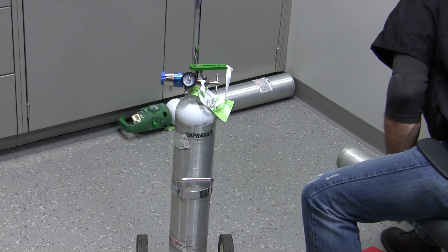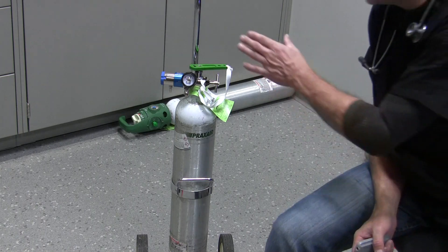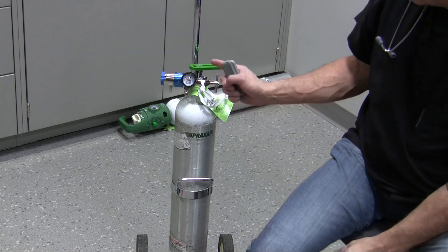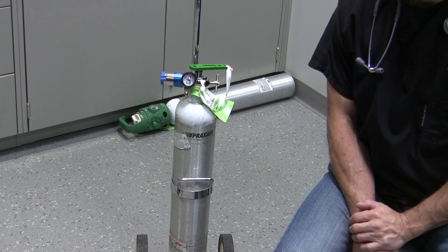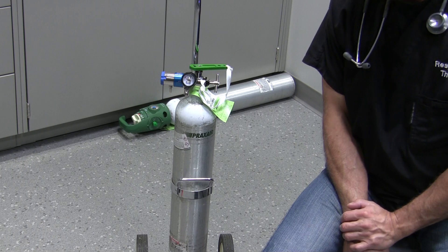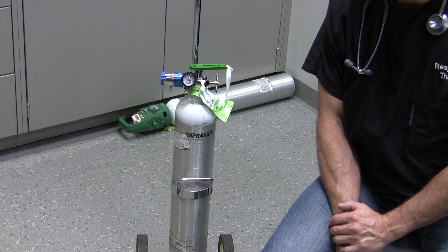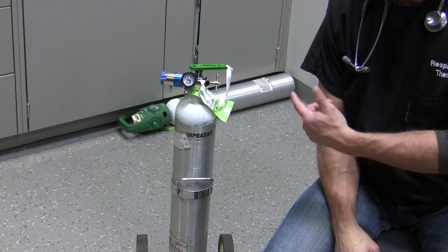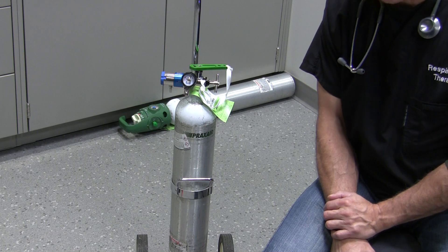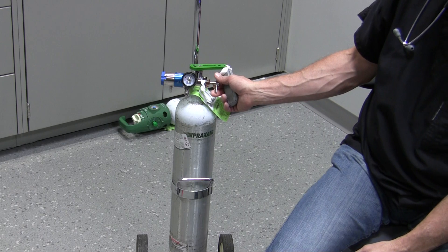The regulator is attached to the cylinder using the pin configuration on the regulator, matching with the hole configuration on the stem of the cylinder. You line the regulator up with the stem of the cylinder, slide the regulator's pins into the pin holes on the stem, and ensure that you've got a proper seal between the inlet of the regulator and the outlet of the stem of the tank.